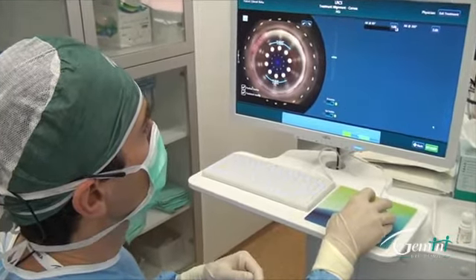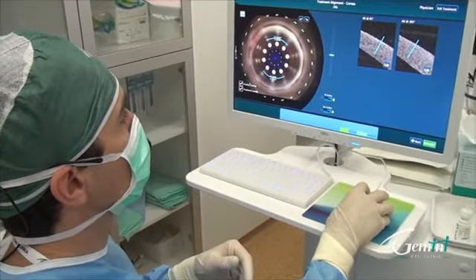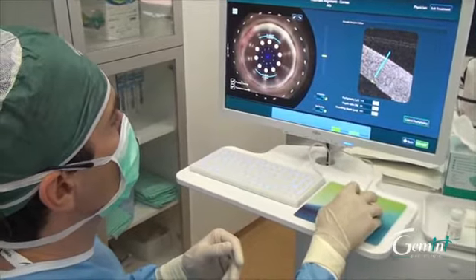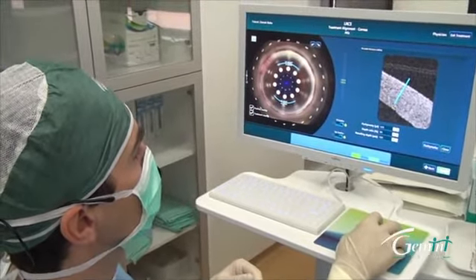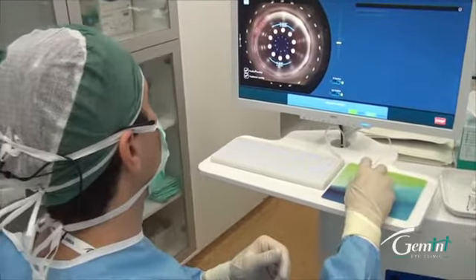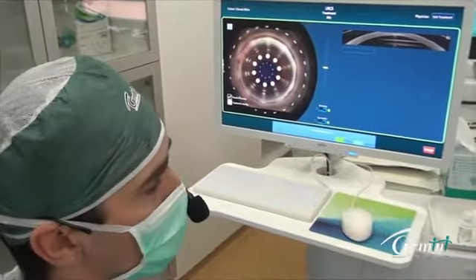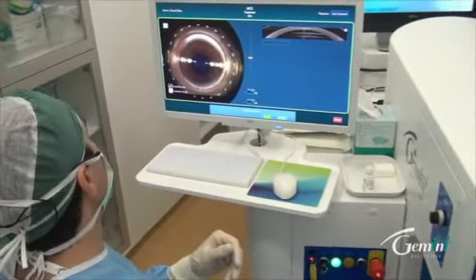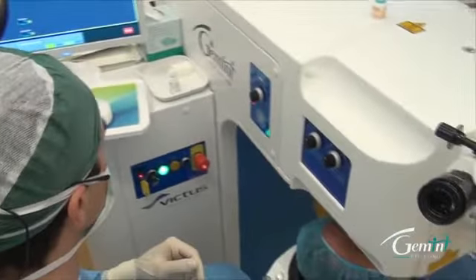We close it, and we can have a look at the incision at 265 degrees. Get an OCT image with higher magnification. We like this. Everything is okay. So we can just start the procedure itself. We can remove the treatment overlay if we want here and change the illumination of the eye, getting everything focused, and start the laser procedure in a few seconds.